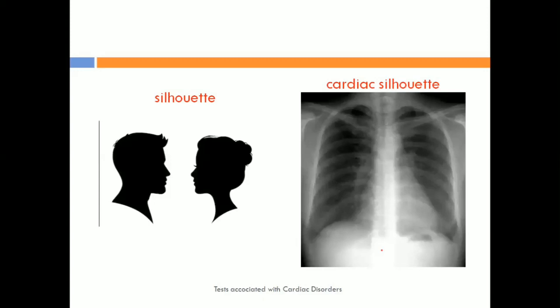Based upon that, the detector will be catching the images and will reflect them with the help of electromagnetic waves and electromagnetic images, right? So whatever black areas you're seeing here, they don't have dense material, meaning thick material to stop the photons, right? So what parts are here? On this side we have lungs. Lungs don't have that much resistance to block the light, so the photons are passing through and reaching the detector to create an electromagnetic image.